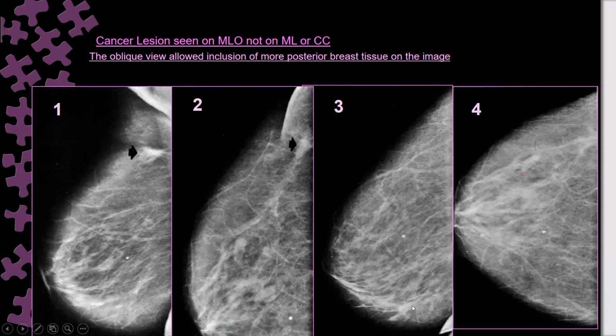I think this is mediolateral. Yes, this is straight lateral. Here you can see the inframammary fold, and you see the nipple in its location here, and the appearance, even the orientation of the parenchyma, is more similar to the MLO. So this is a straight lateral view. Okay. So what do you expect this view to be? This is extended lateral. Excellent.